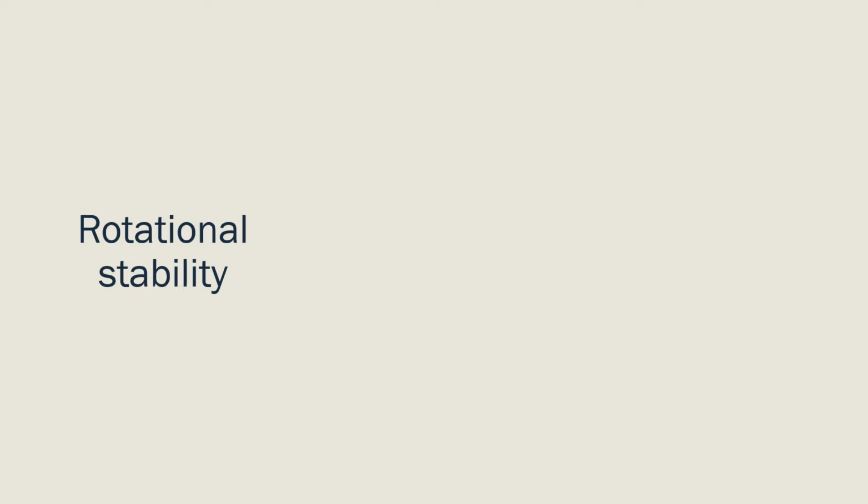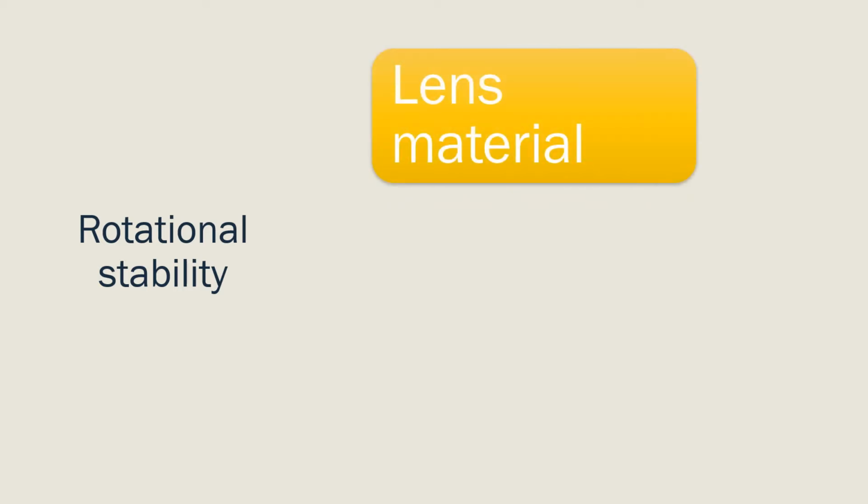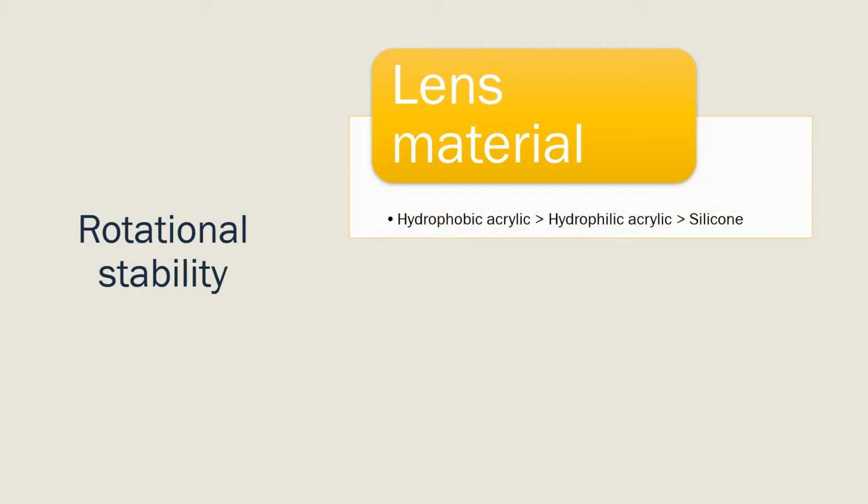So rotational stability is the thing we probably focus on most with toric IOLs, and this is related to both the lens material and haptic design. Hydrophobic acrylic IOLs have been shown to have the best rotational stability, and it's thought that this is because stronger adhesions develop between the capsule and the lens in the early postoperative period.